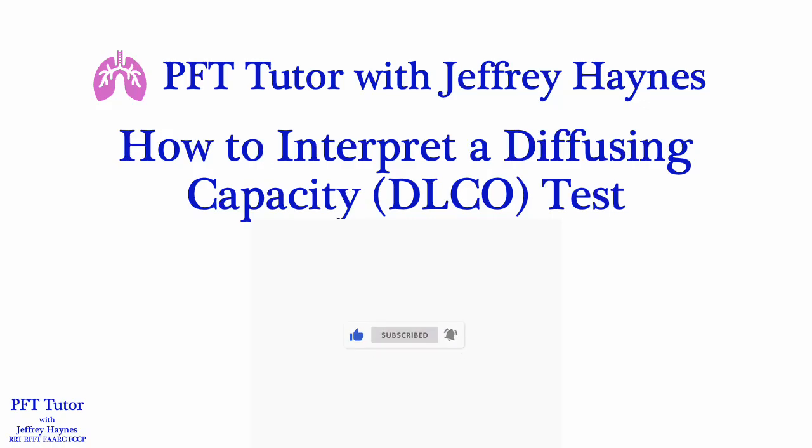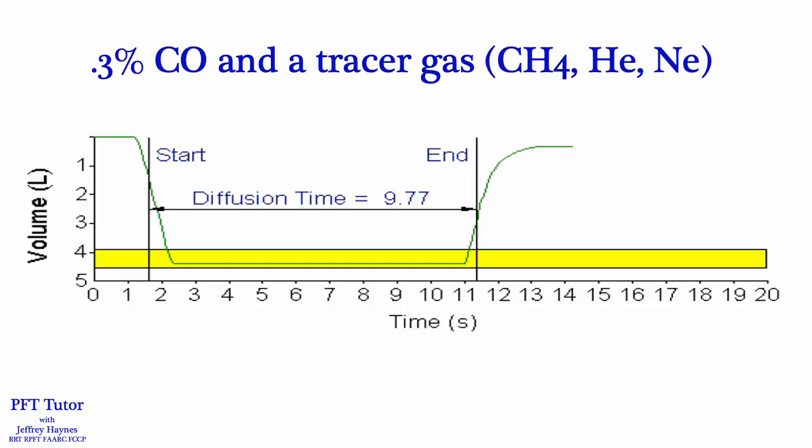In this video, we'll review the interpretation of a diffusion capacity test. DLCO is one of the more complicated PFTs, both technically and physiologically, so in this video, we'll discuss the fundamental ideas needed to properly interpret a DLCO test. So let's do a quick overview of the single breath DLCO maneuver.